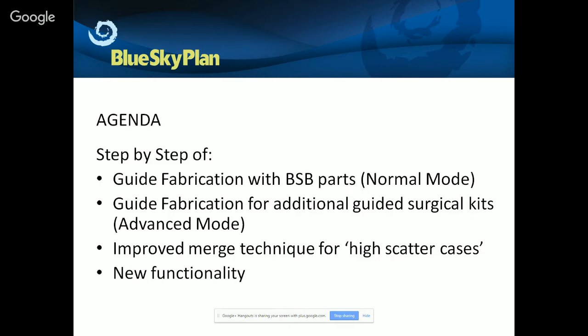The agenda for the presentation is we're going to be providing a step-by-step process of a couple of different situations. In the presentations I've given in the past, we're using the Blue Sky Plan software directly showing the cases. This time I decided to use PowerPoint, which has its disadvantages, but the advantage is that the step-by-step process flow being created, if anybody wants to receive it for normal mode, for advanced mode, for a particular situation, we'd be happy to send you that set of slides, and then you could use it kind of as a help to go through the process together with the step-by-step.